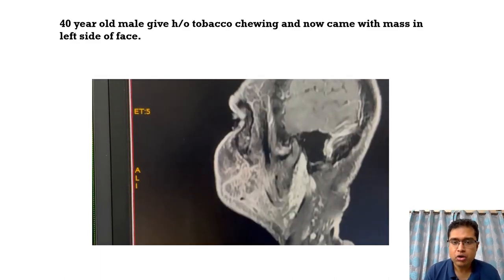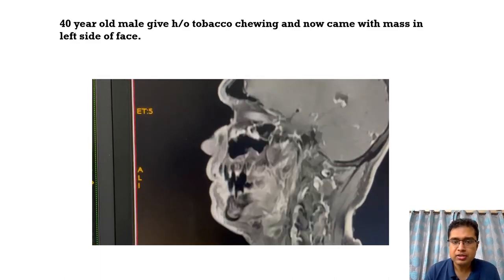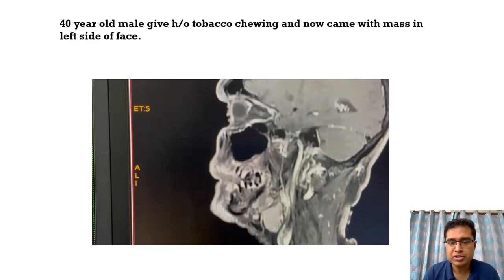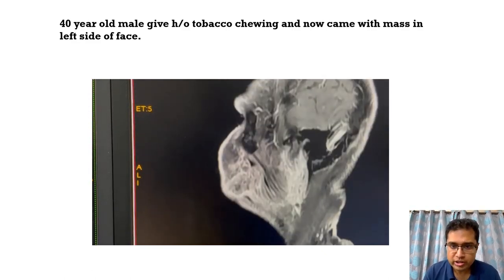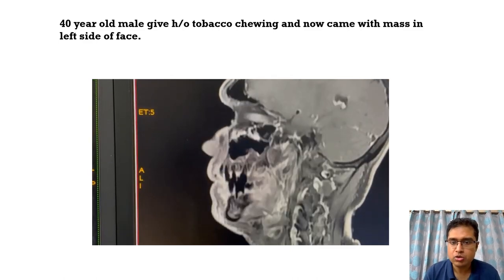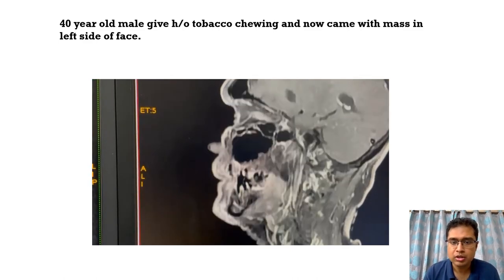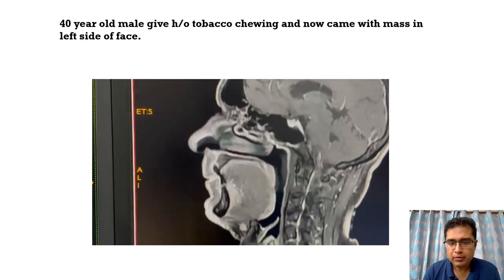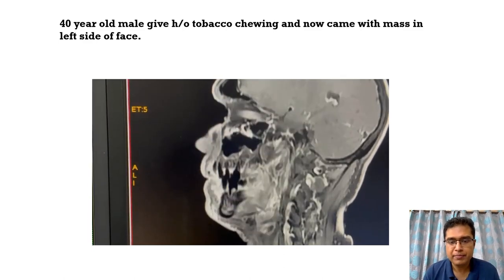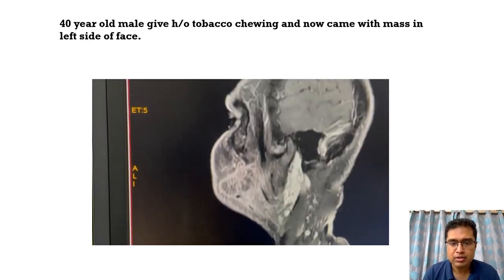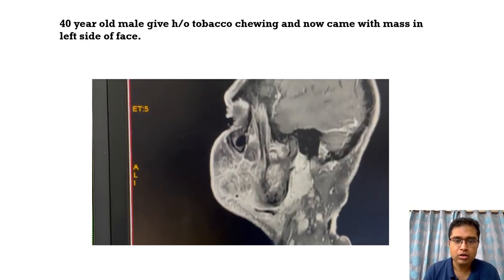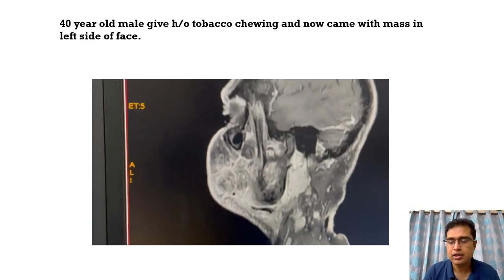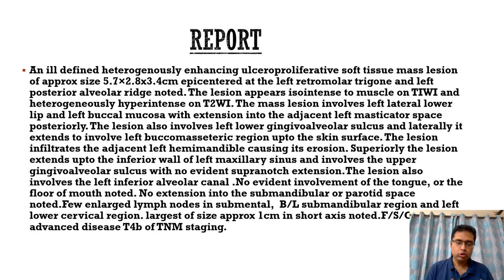On the sagittal post-contrast images, we can see this heterogeneously enhancing mass region, and importantly there is no supra-notch extension of this mass. There are some nodes in the submental and submandibular regions. The mass does not extend to the supra-notch area, and the skull base is also clear.